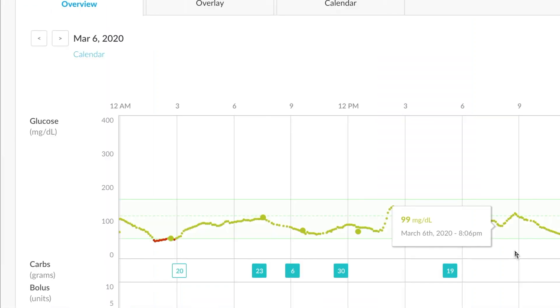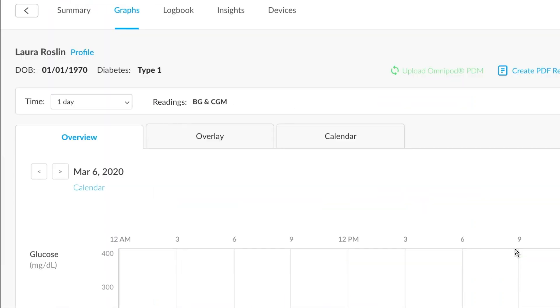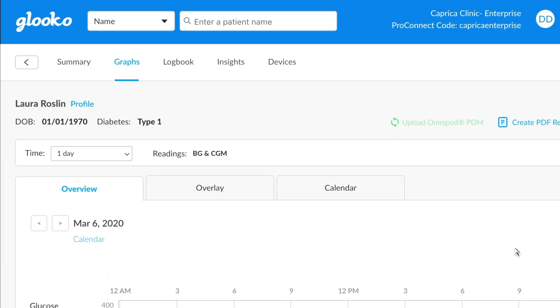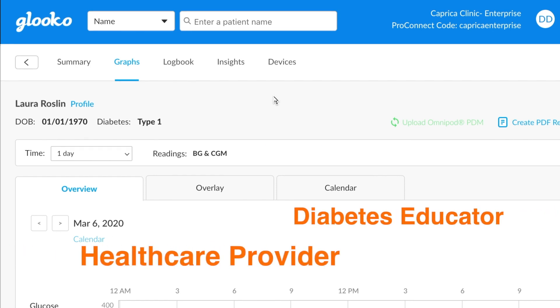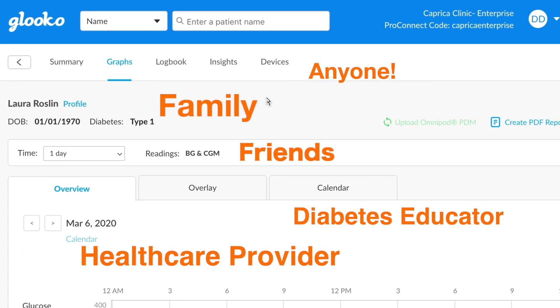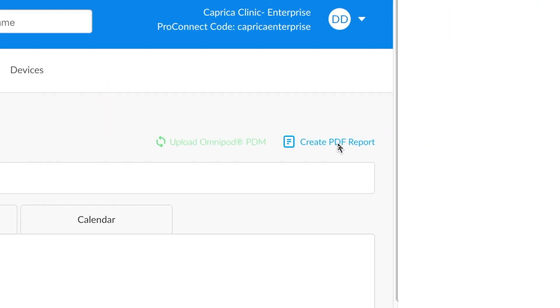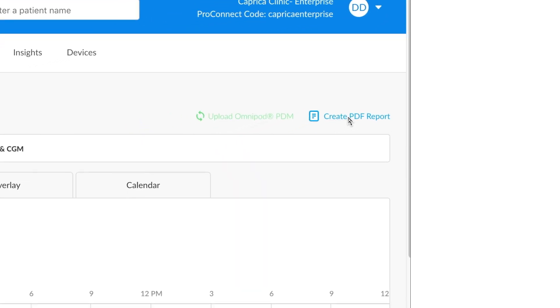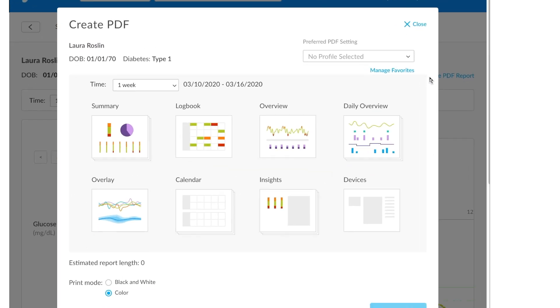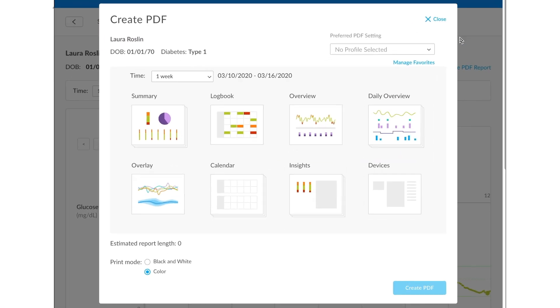Okay, now that we have all this great information all in one place, what do we do next with it? One of the really great features about GLUCO is it allows you to easily share data with really anyone. To create a report, you'll click on the Create PDF Report option here in the upper right hand corner. You'll see it displays a pop-up that allows you to make additional selections.